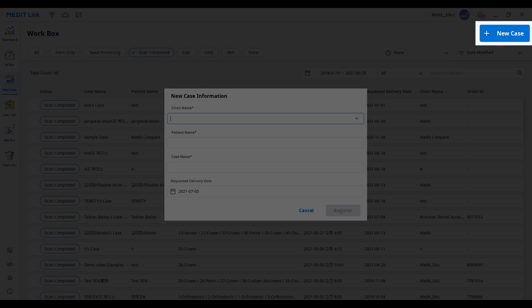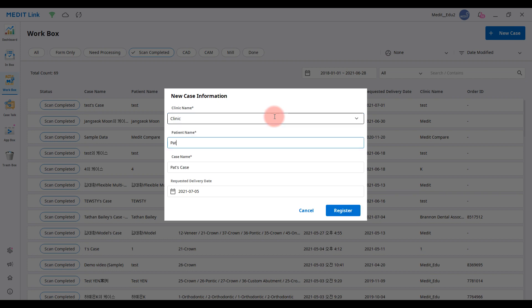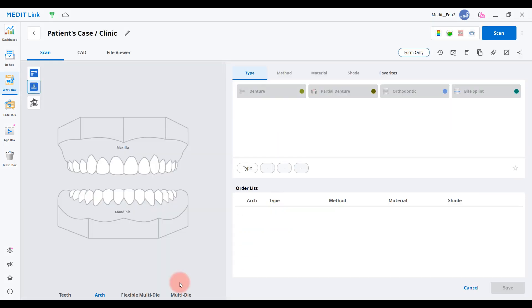First of all, create a new case. You can create a case by clicking the New Case button on the top right of Workbox. Please complete the order form by following the prescription.